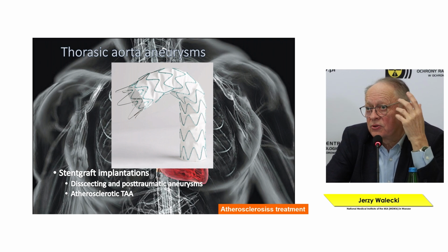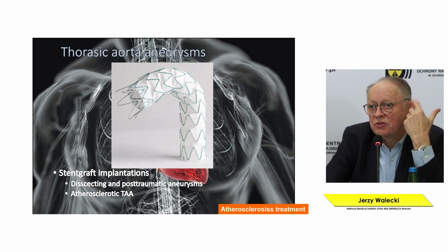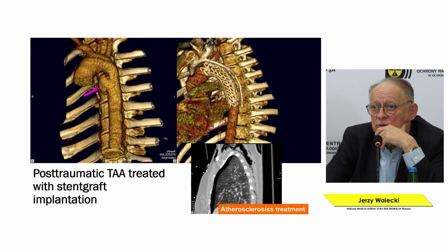The mortality risk very much depends on the time of implantation of the stent. So here you can see the grafts used in these kinds of aneurysms and stenoses.